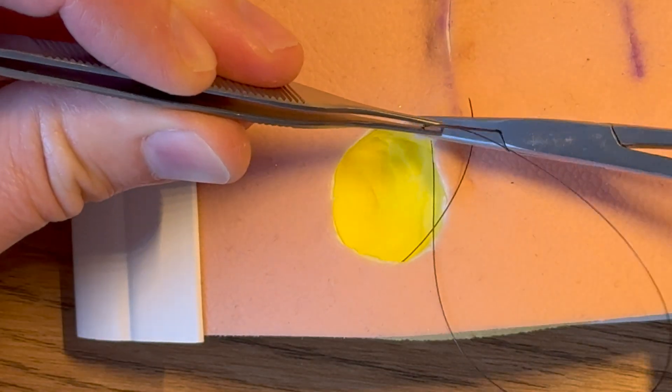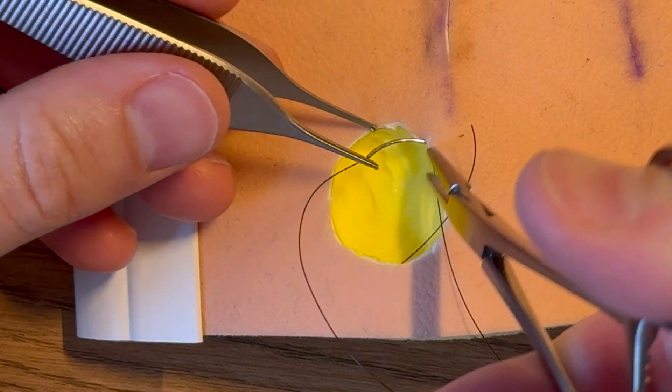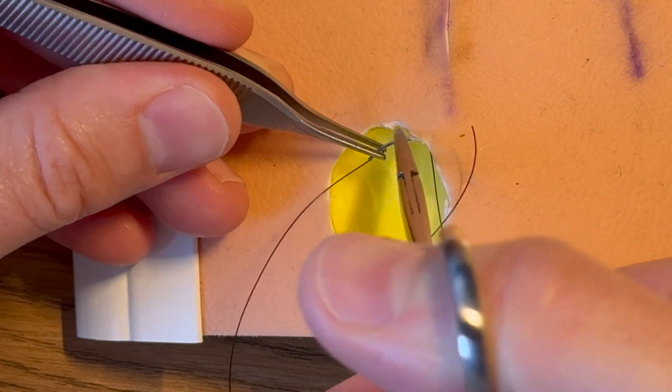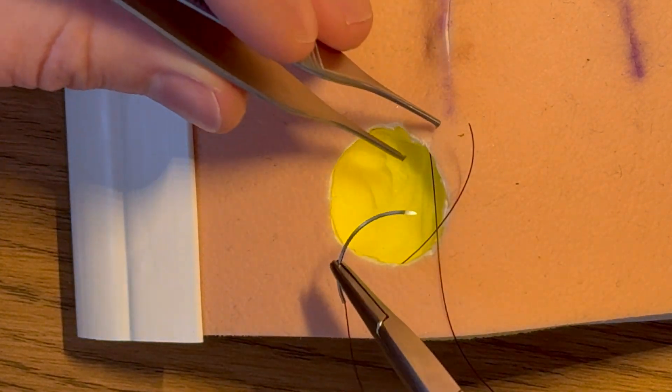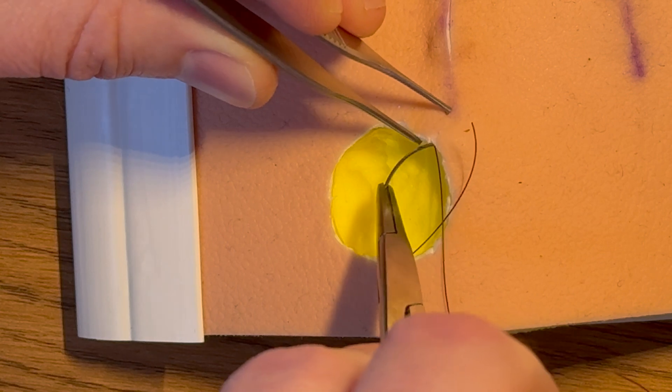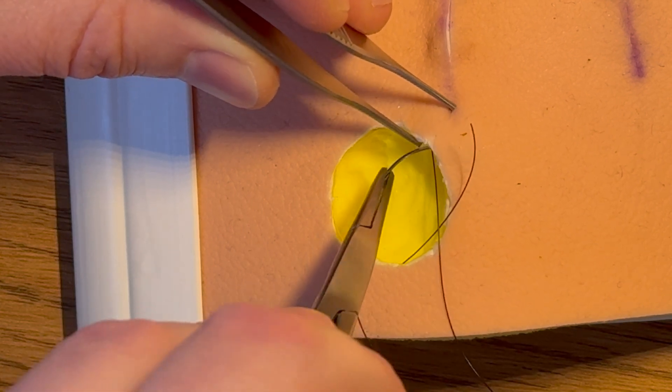And you see there I've taken too big a bite because I'm getting caught up a bit and then it's just not holding properly in the instrument, so let's take a different position. And you see I'm kind of making it awkward for myself sewing backwards against myself.